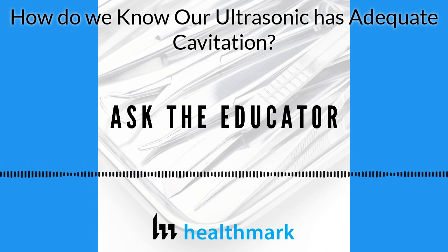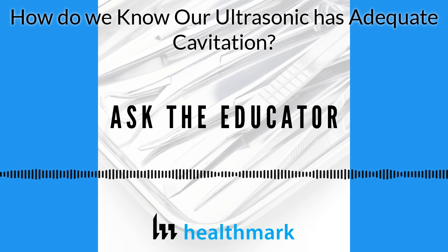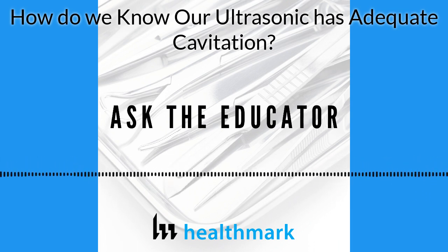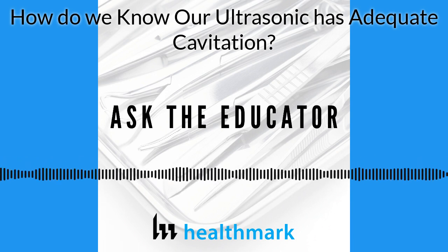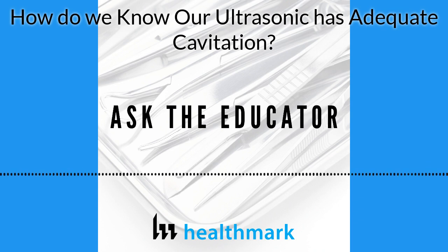And then it's used as a PQ step, because your performance qualification is what you're trying to prove every day. Is this working? Am I getting enough cavitation? If not, what is wrong? And we know that people can place it in certain areas, because we can also prove on a single level, if you take a tray of instruments and put a massive load of instruments there and you don't spread them out properly and you don't open them up properly, you can put SonaChecks around those instruments and even in the very middle and run it for some people 3, 5 minutes, 10 minutes.